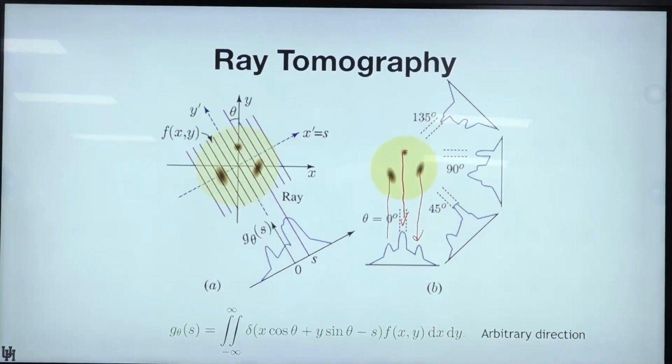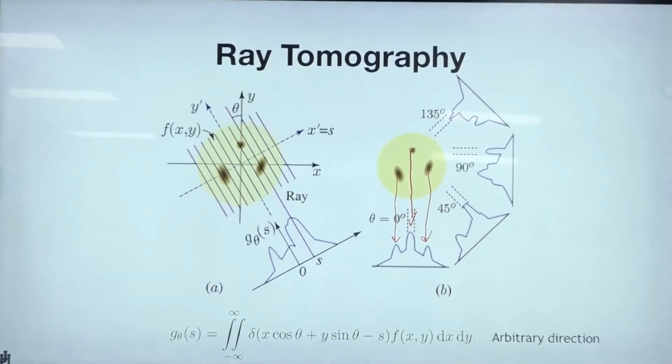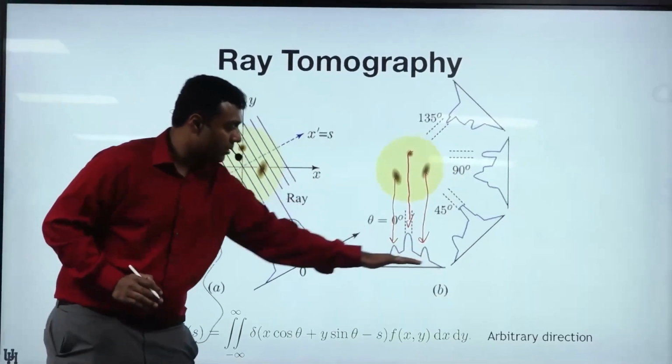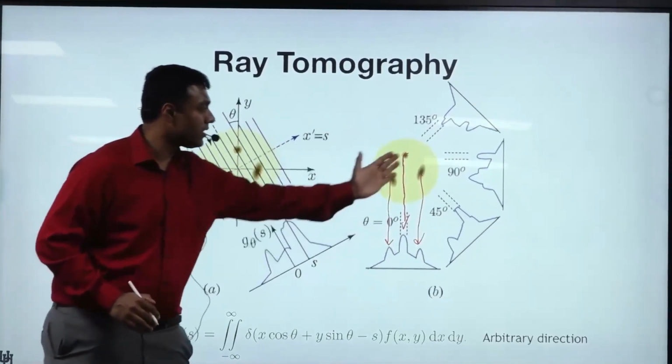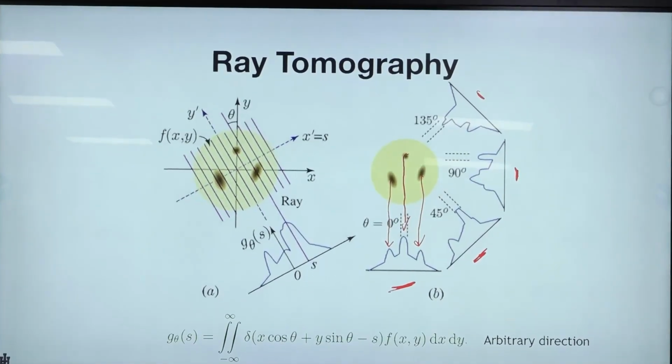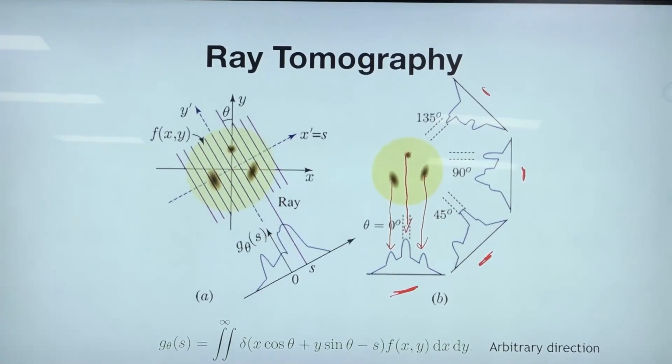This circle gives you this peak. And the overall absorption inside gives you the overall shape at the bottom. So this is how you can think about the set of measurements. Notice that these measurements look slightly different from each other, and we will put together this data to give the overall final output.